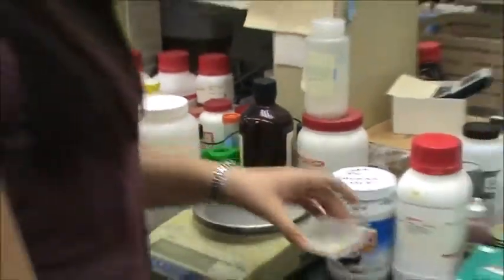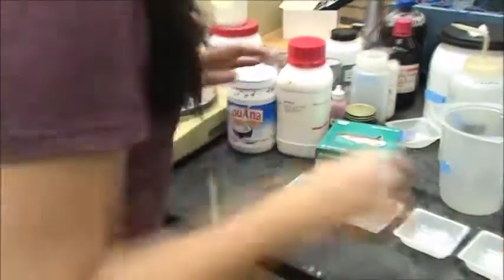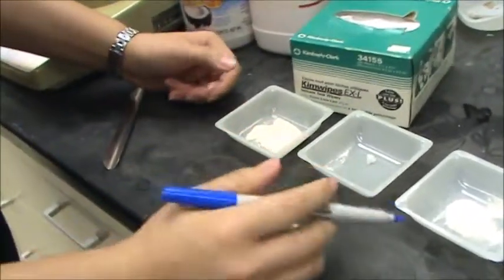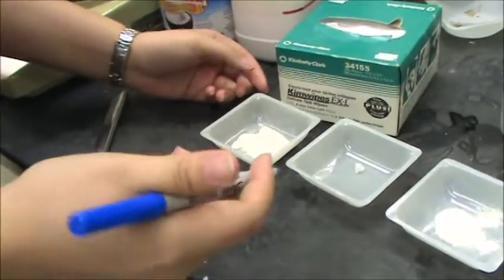So after you measure all your ingredients out, the best thing to do is to label just to make sure you don't get them confused because as you can see we have two different forms of agar, but they're different measurements.